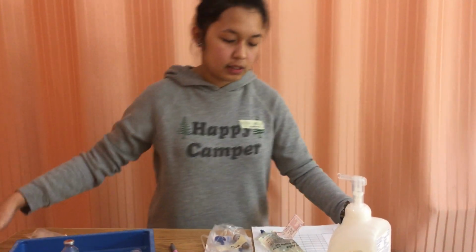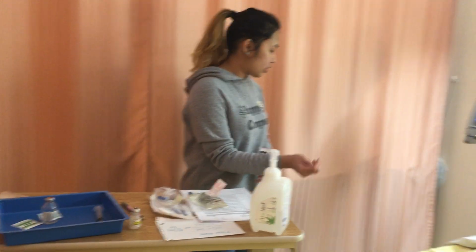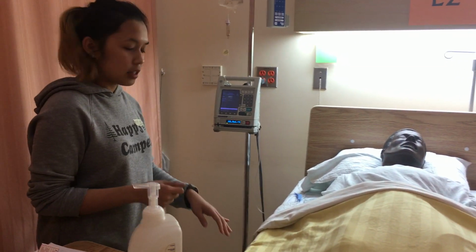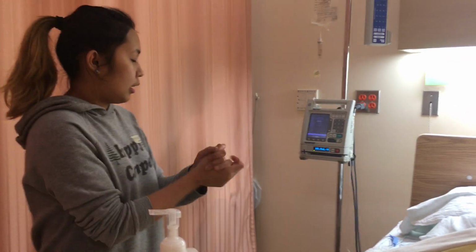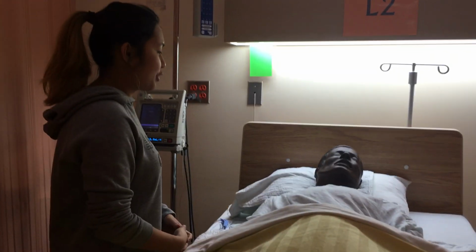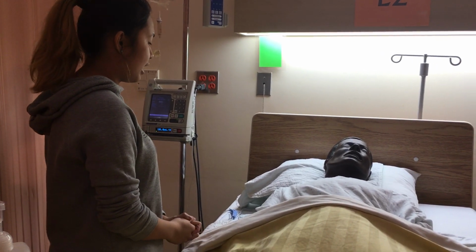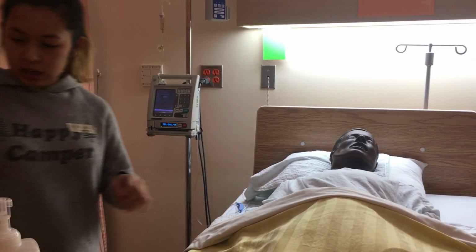So I'm going to the bedside. As I walk in, I'm going to do my safety check, make sure that nothing is on the ground, that the patient is not in distress, and I'm also going to do the hand hygiene at this time. I'm going to introduce myself. Hi, Miss Phalange. My name is Raika, and I'm your student nurse for today. I'm going to be giving you your medication.